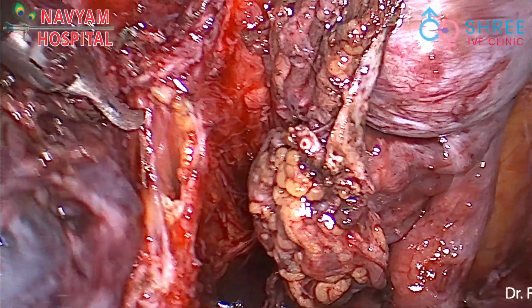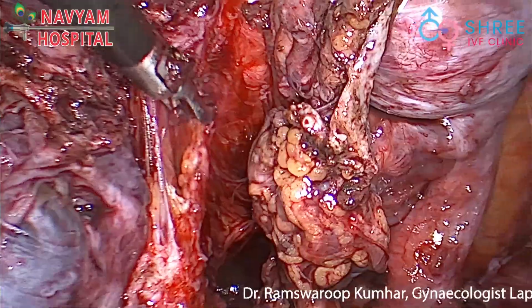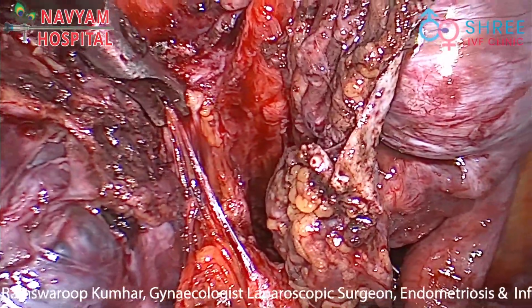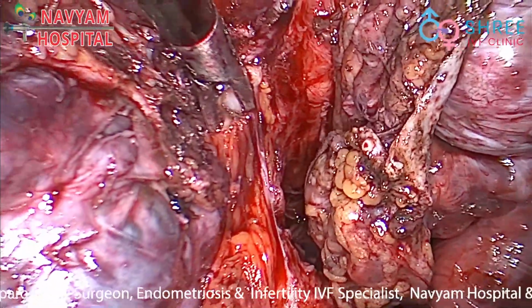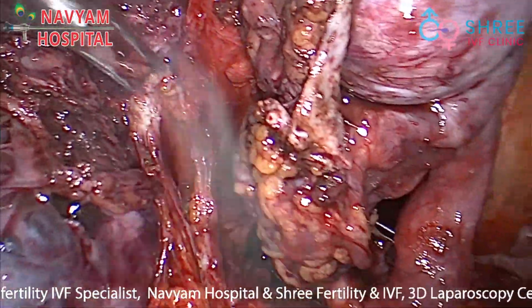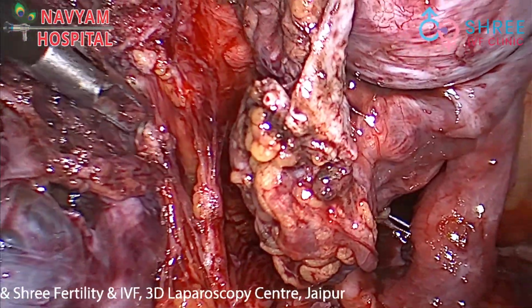Now we have entered into the clear plane. Both leaves of the Denonvilliers' fascia are being opened, but it's slightly difficult because of the endometriotic adhesions. So blunt as well as sharp dissection was carried out here to dissect the rectum.